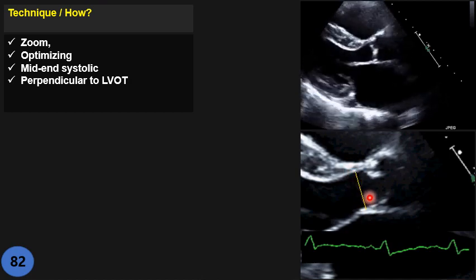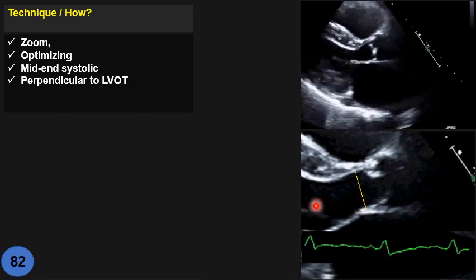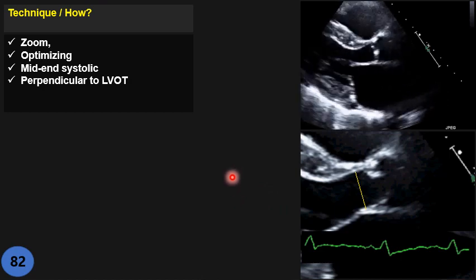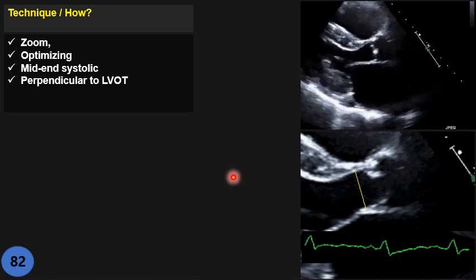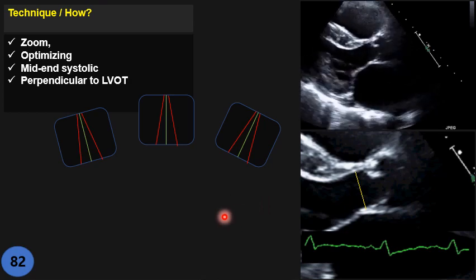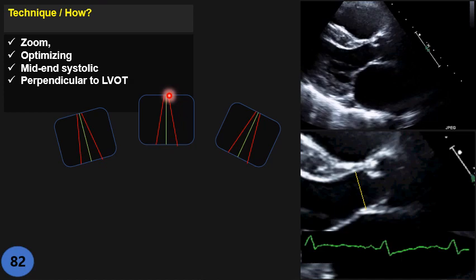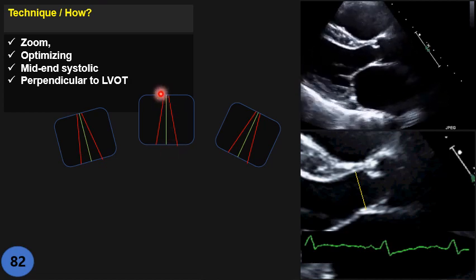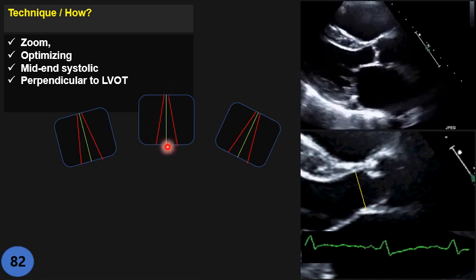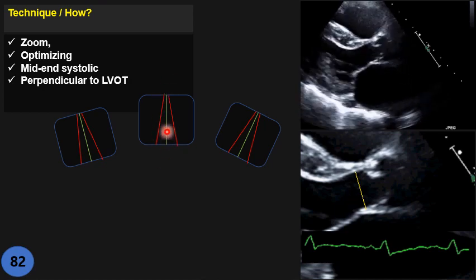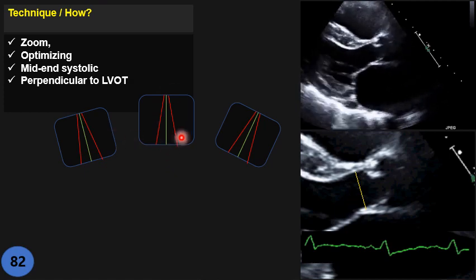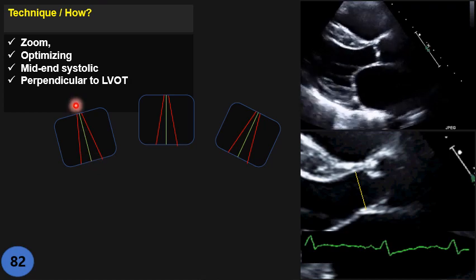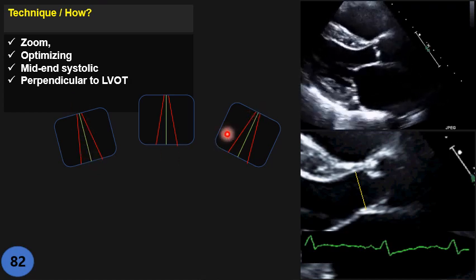The measurement should be inner to inner, perpendicular to the vessel wall — that is the correct measurement. Many techs are still confused about perpendicular measurement. To clarify: imagine this is your LVOT with anterior and posterior borders. Perpendicular means your measurement line should be at a right angle to both vessel walls. On this diagram, only the green line is correct. It doesn't matter what orientation your structure is — it must always be perpendicular to both walls.